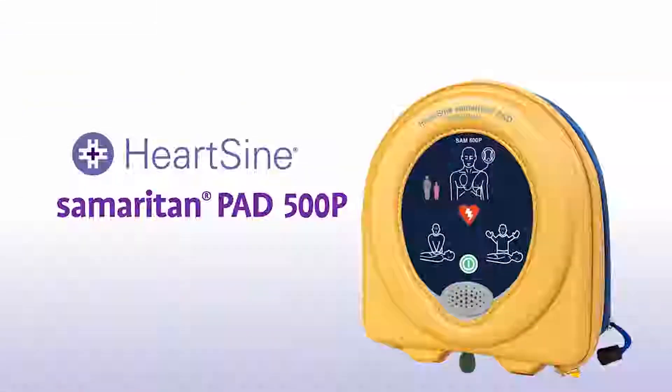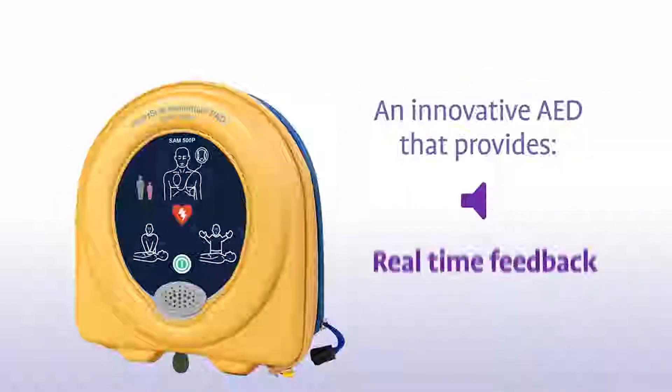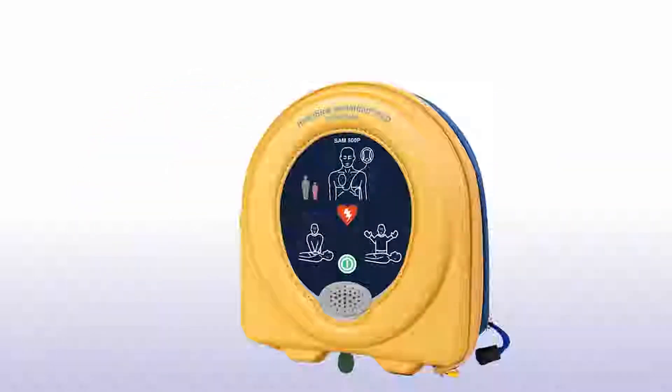The HeartSign Samaritan PAD 500P featuring CPR Advisor is an innovative AED that provides real-time feedback on the rate and force of compressions during CPR. Let's look at how to use one in a life-saving situation.